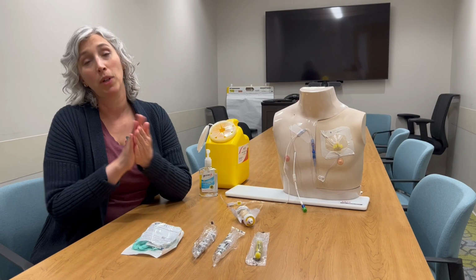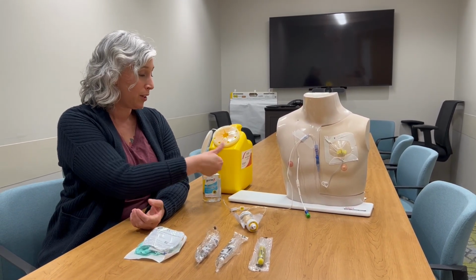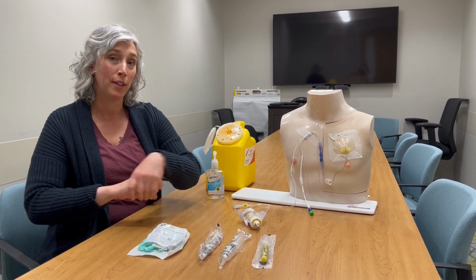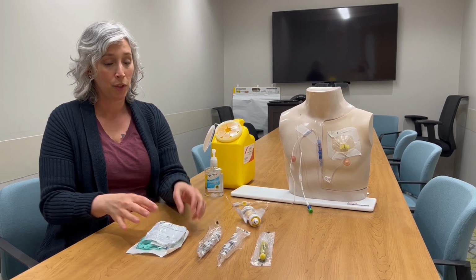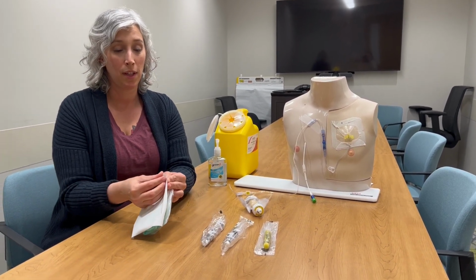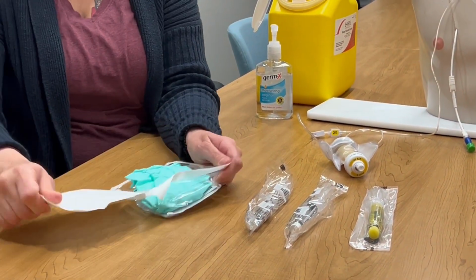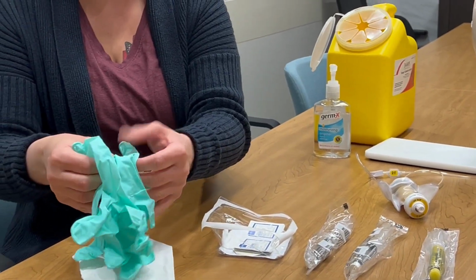Then you're going to make sure you wash your hands with soap and water and dry with a paper towel, or you can use alcohol hand gel. You want to clean your hands before you get started on the disconnect. First, we're going to open up our kit and put on the chemo gloves. There are 2 pair in here.